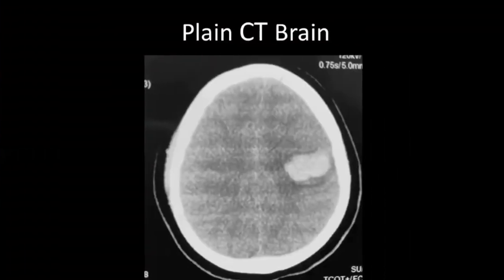I'm provided with a CT scan brain axial image showing a well-defined hyperdense rounded lesion in the left parietal lobe, having very mild surrounding hypodense edema, and no significant mass effect. The adjacent sulci and gyri pattern cannot be well appreciated. The contralateral cerebral hemisphere appears normal. In context of my findings, it's a hematoma, most likely on the basis of history and the imaging findings. It's most likely a bleed.